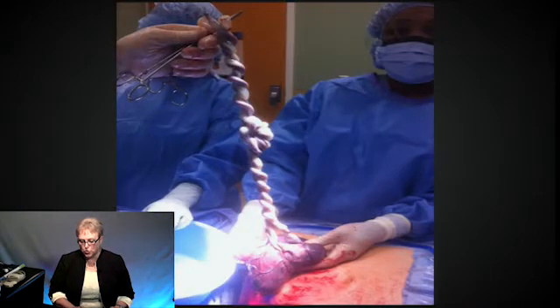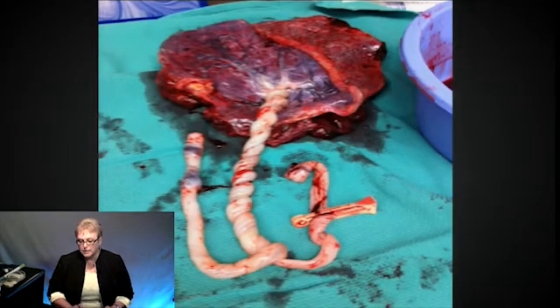So look at this cord. Look at the twist, even a true knot in there. So these babies, we rarely will let them go past 31, 32 weeks. Usually by 30 weeks, we admit them. If it looks like they're getting into trouble, then we just go ahead and have the steroids on board and get the lungs as mature as possible and deliver, because they are at a very high risk for cord accident. And this is another baby. Look at this cord.